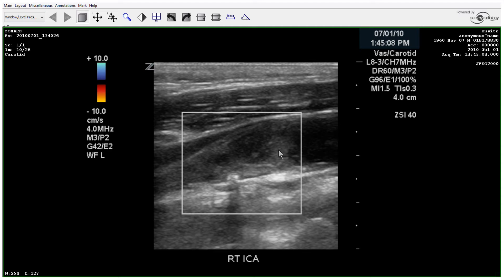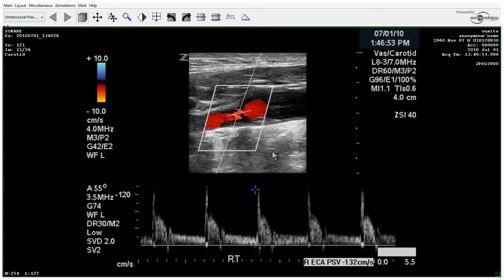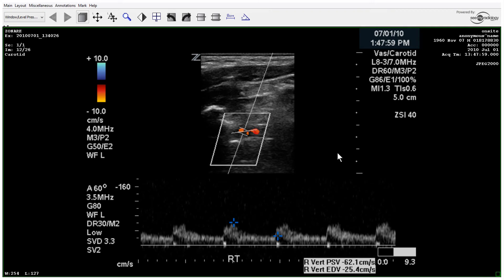The sonographer has employed the color Doppler and turned down the PRF, which gives you a good idea that this is totally occluded. We could also turn on the power Doppler and put a spectral gate within that lumen, but we've got a pretty good indication that it is totally occluded. Here's the ECA — a normal waveform for an ECA, though there is some increased diastolic flow.